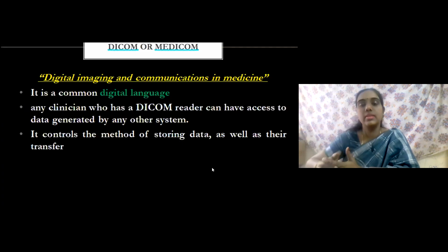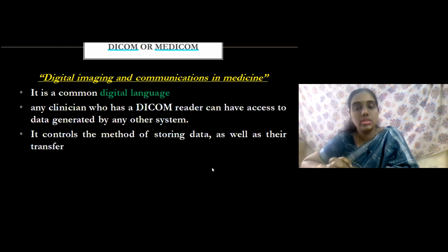So what is DICOM? DICOM is nothing but digital imaging and communication in medicine. So the data is in digital form, and the communication between the computers takes place with the help of this language. So it is just a language, a computer language. Any clinician who has a DICOM reader or software will be able to access any three-dimensional volumetric images which he has.